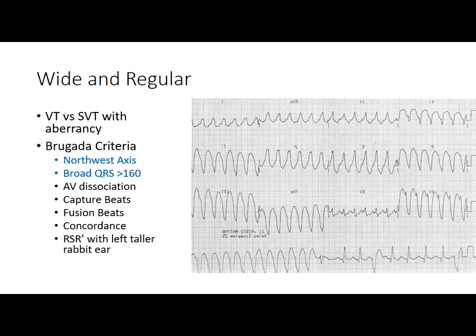You've got a ventricular arrhythmia. Your electrical activity is going to, for the most part, be going up towards your right shoulder. There are a lot of exceptions, but if you're starting low and going high, it's going to give you a positive deflection in aVR. So you can see each beat starting here is going up, up, up there, up there. That is called a northwest axis because the axis of your rhythm is going towards your right shoulder. That is a very strong indicator that your rhythm is VT.